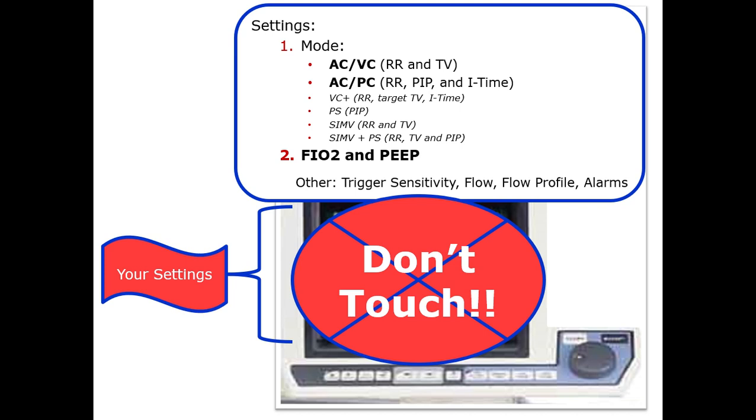And there are even more restrictions on this presently than used to be the case. In some of our ICUs, they even don't want board-certified critical care attendings touching the settings on the ventilator. So please don't. You can get into a lot of trouble. Now, if you're with a pulmonary fellow and they say do things, sure, for learning purposes, but on your own, do not fiddle with any of the settings. Hate to be very draconian about that, but you can get in a lot of trouble. More importantly, patients can get into a lot of trouble.